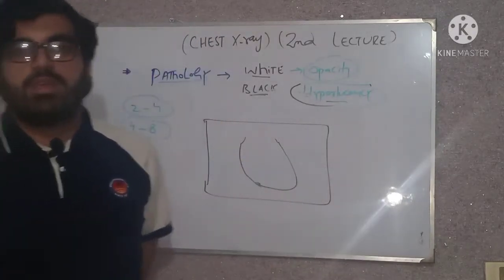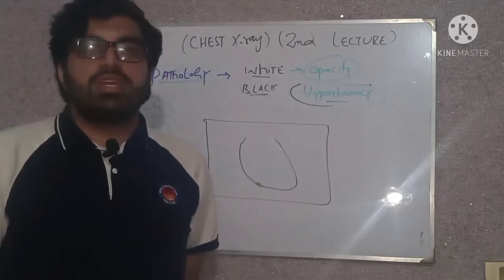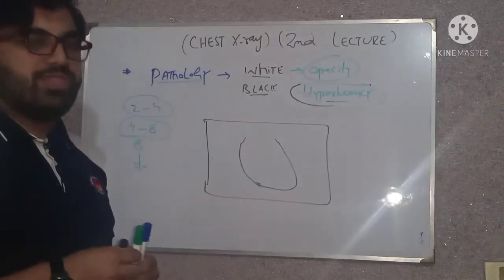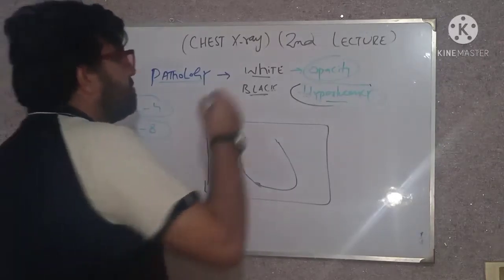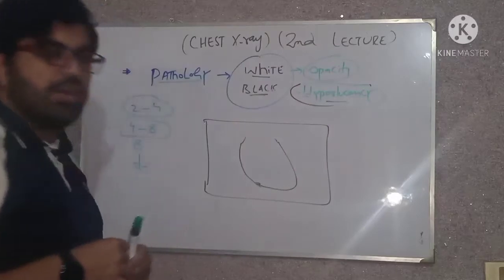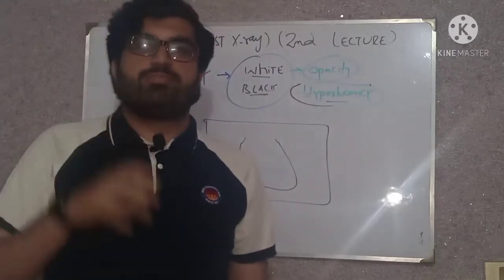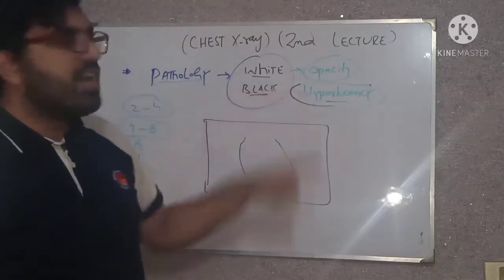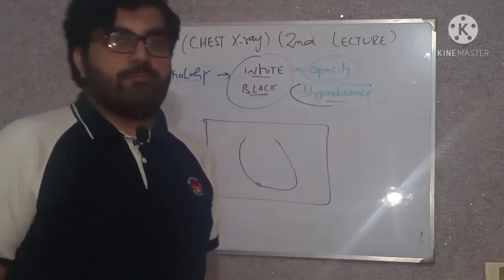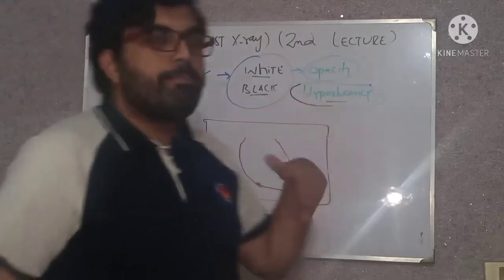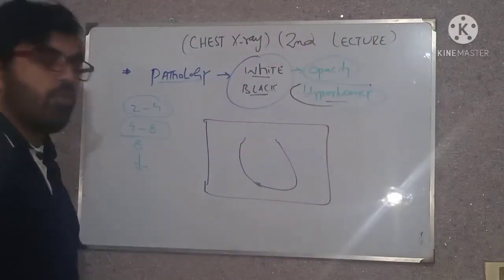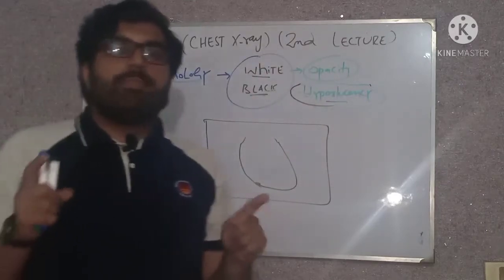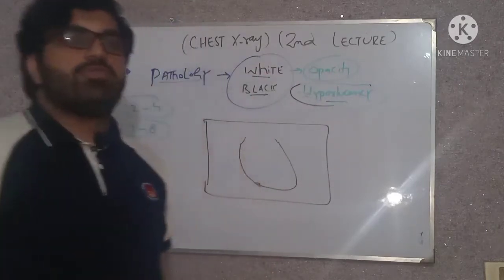After applying the basic quality criteria, we move toward the pathology. Which pathology can you expect in a chest X-ray? The answer is: either the pathology is white or the pathology is black. The white pathology is called opacity, and the black pathology is called hyperlucency.